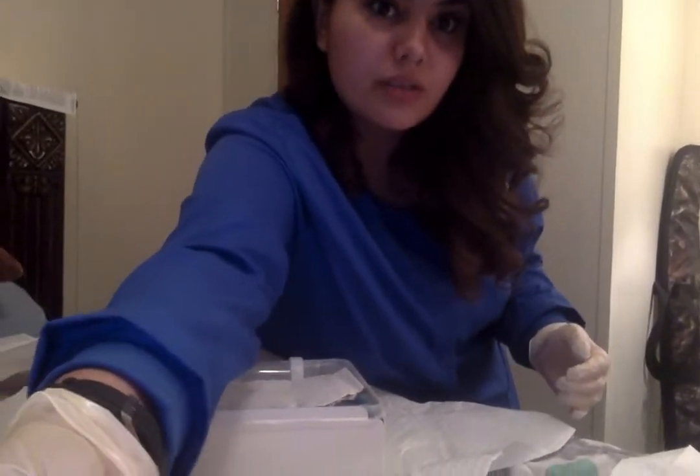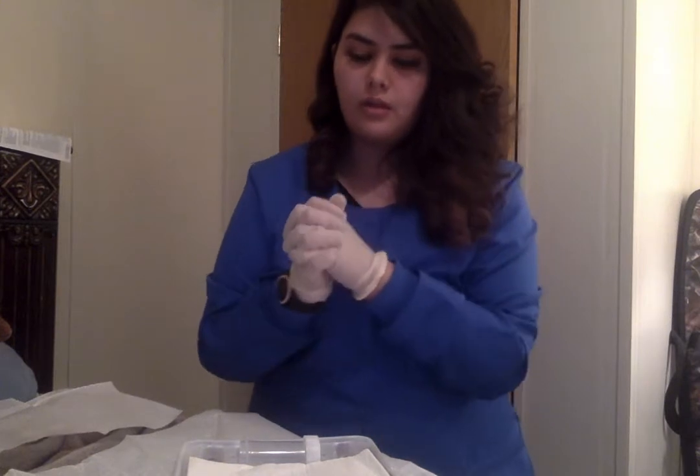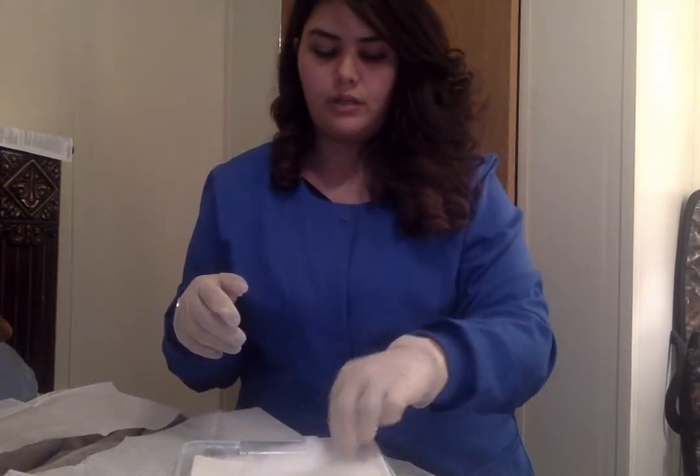Pretend that my gloves are still sterile because I need to move the camera in order for you to see what I'm doing. Okay, so if the camera had never moved, my gloves would still be sterile. Okay, so praying hands.